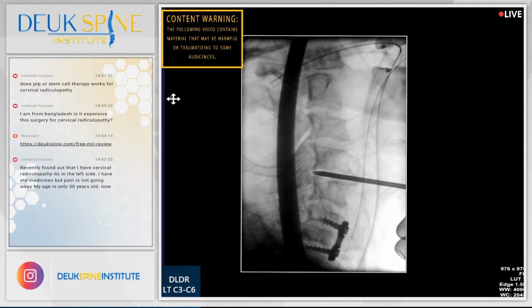You guys see the tip of the dilator is where the herniation was. Look where the herniation was, guys. Look at that white area. You guys see the little white, like mushroom cap on the side? Yes, we do. That's where the herniation was. It's gone now. Don't touch anything. All right, AP.